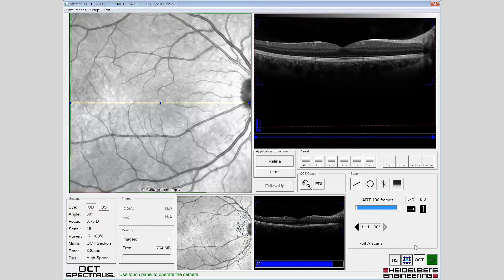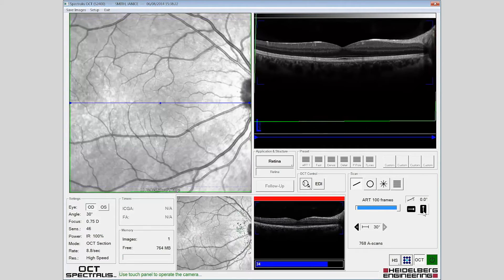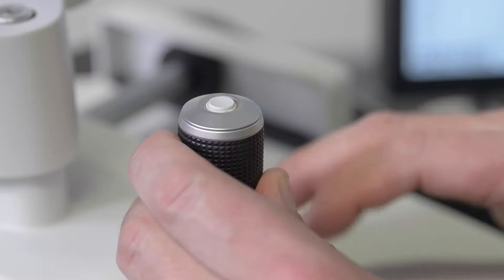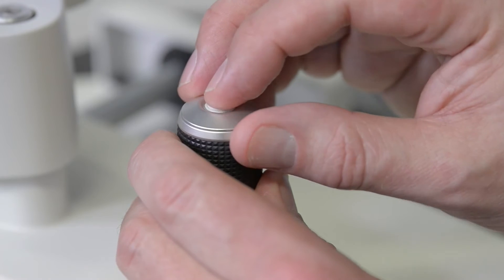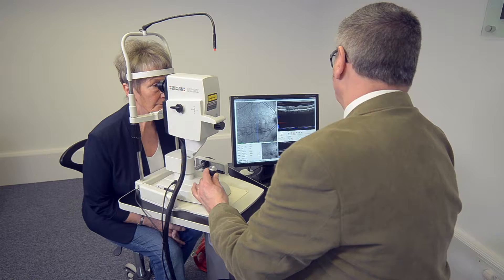The vertical scan should then be selected, again allowing the ART value to build to 100 before acquiring the image.